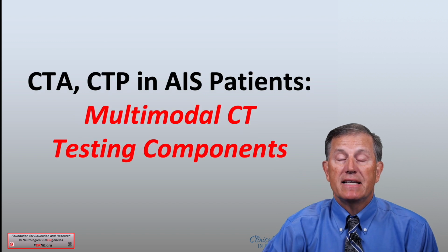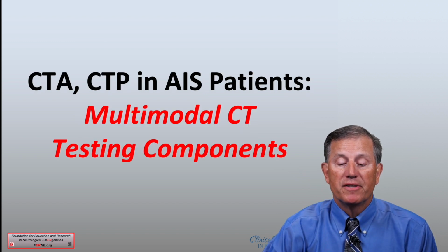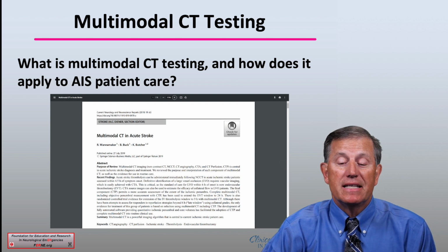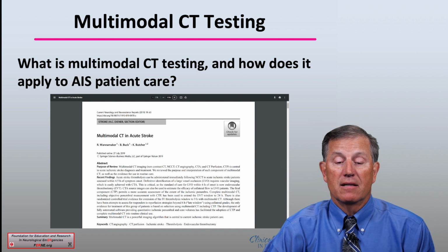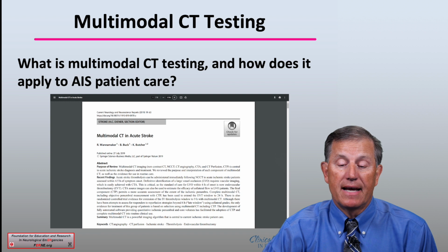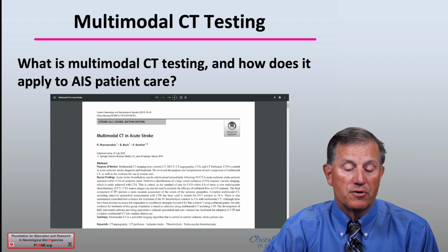When we talk about CT studies, we are talking about multimodal CT testing and its individual components. So what is multimodal CT testing and how does it apply to acute ischemic stroke patient care?